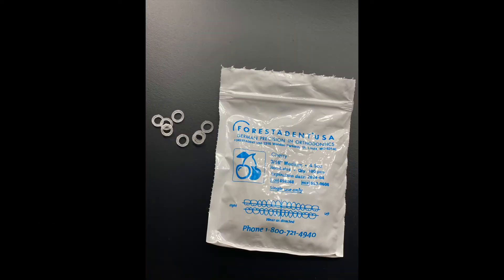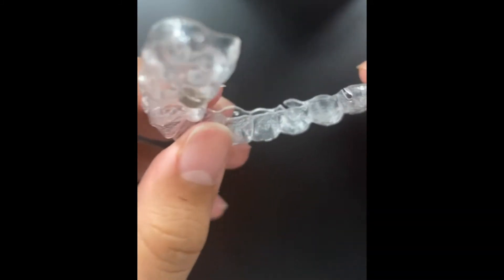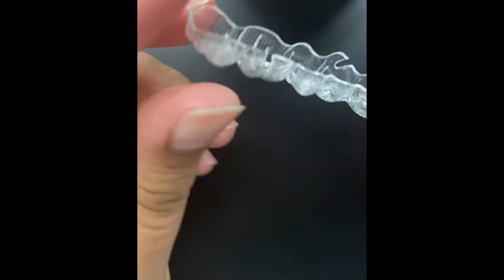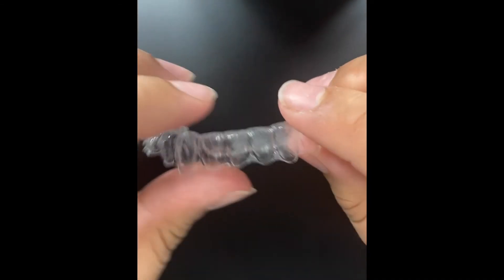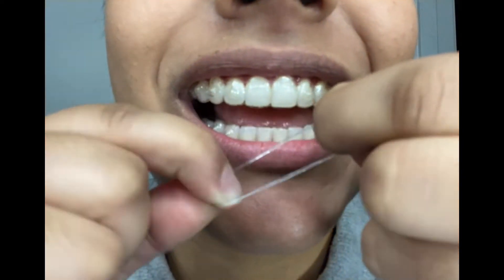This video will go over cross elastics. You should have some elastic baggies inside of your aligner boxes with cross elastics. You will either have cutouts on your actual aligners, or we might have placed some actual metal hooks. Either way, the elastics are still going to be worn the exact same way.